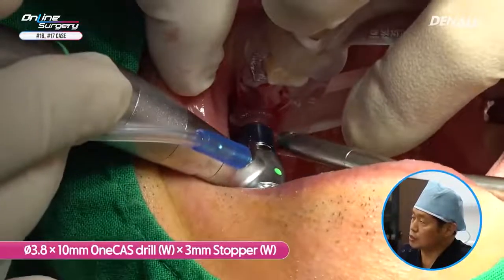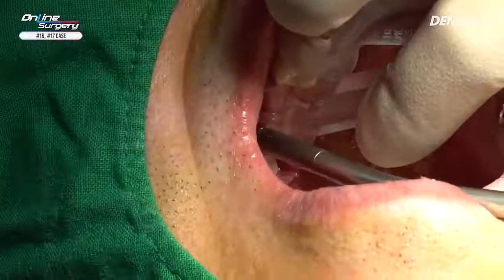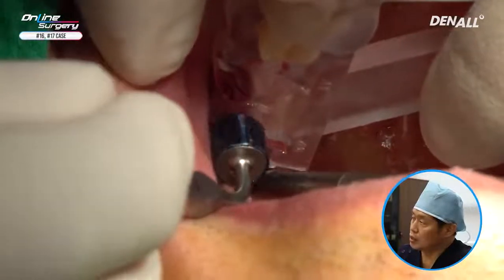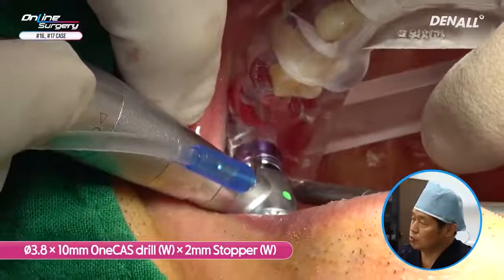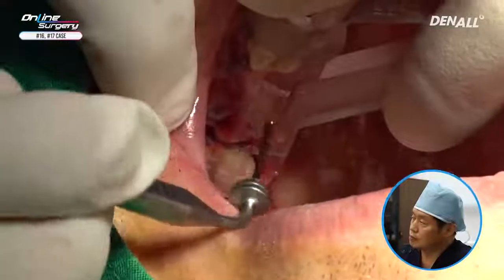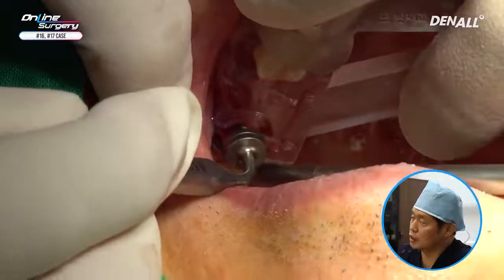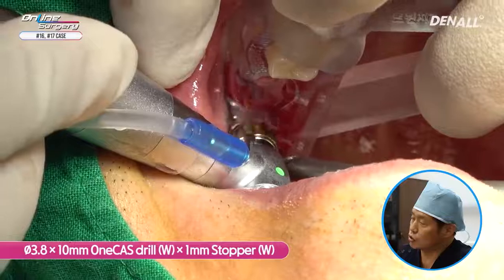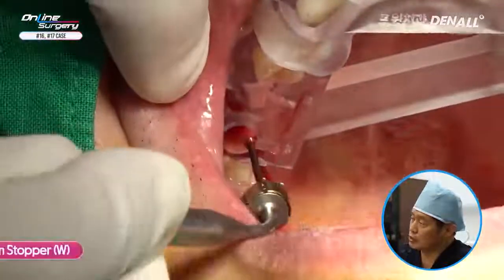3.8 by 10 mm drill and 3 mm stopper is connected, so drilling up to 7 mm is done. Next, depth gauge with 3 mm stopper is used to check for penetration. Next, the 10 mm drill with 2 mm stopper, so drilling up to 8 mm. Depth gauge without stopper is used to check. Next, I'm going to use 1 mm stopper and drilling is done up to 9 mm.